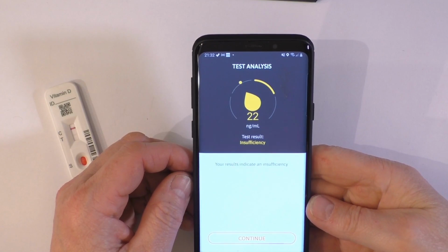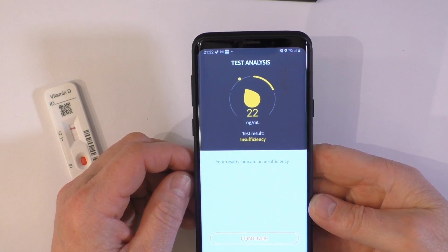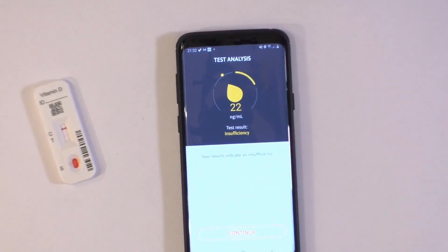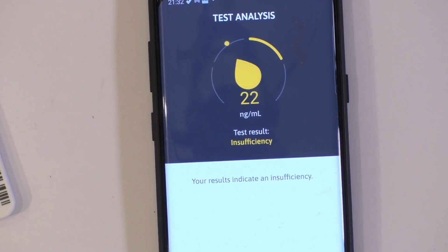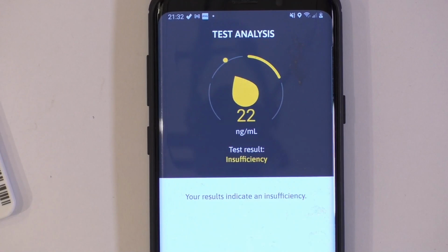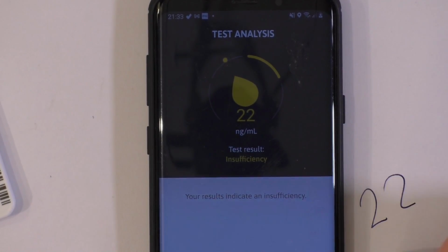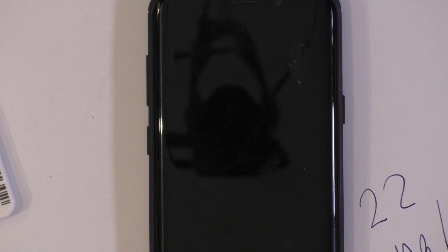And my result is 22 nanograms per mil. Now I am pretty surprised. That is actually quite a bit lower than I would have thought, because I've been taking 2 to 3,000 units of vitamin D a day. Let me just write that down, 22 nanograms a mil. Now, I'm a little surprised it's as low as that. That is really quite interesting. And this is all genuine. I'm doing this completely live time.